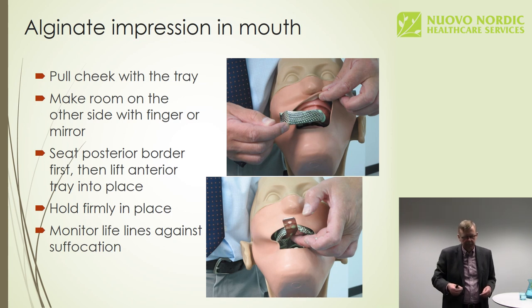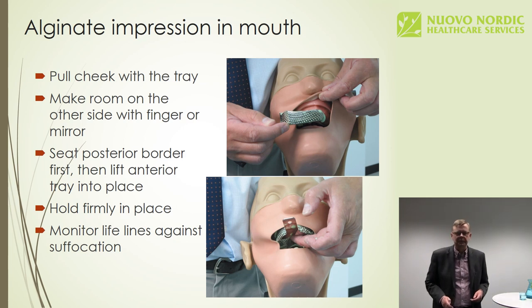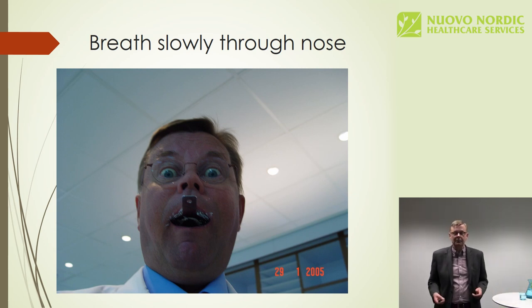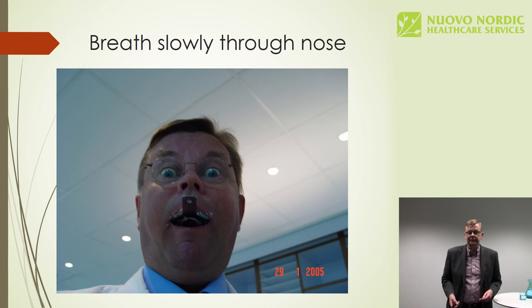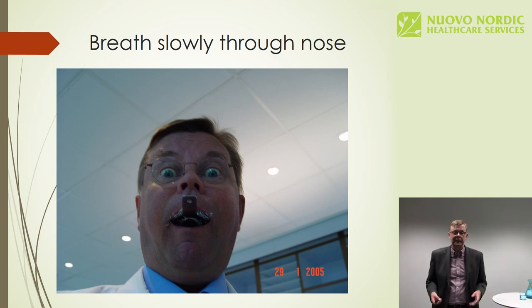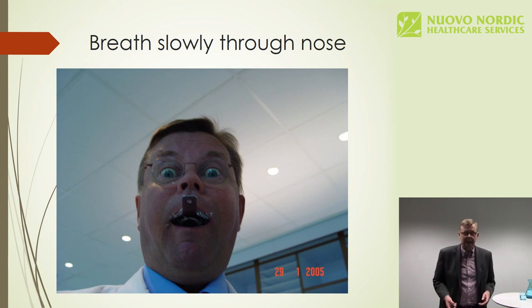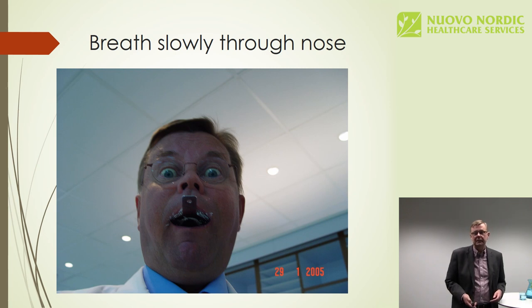In the maxilla, try to remember to seat the posterior border of the tray in place first, and then lift the anterior. In that way, the excess will flow forwards, and there will be less suffocating material going into the throat. You have to monitor the patient all the time, and perhaps you can talk with him or her. In this picture you can see how difficult it sometimes is for the patient, and of course I didn't want to bother a patient for this picture, so this is myself.